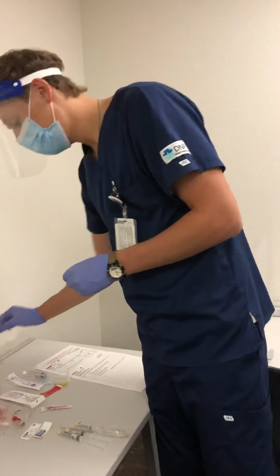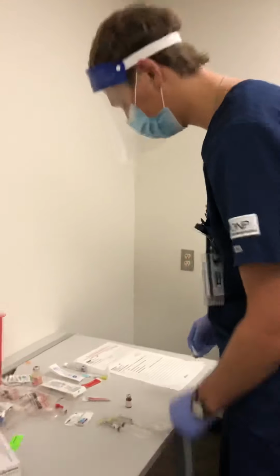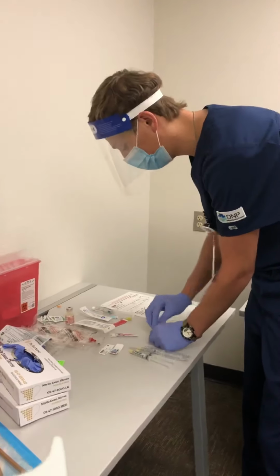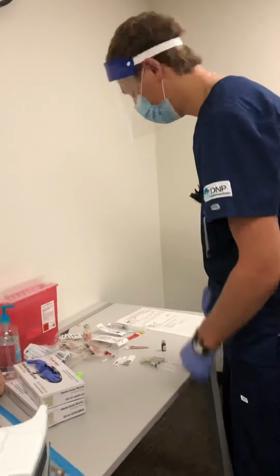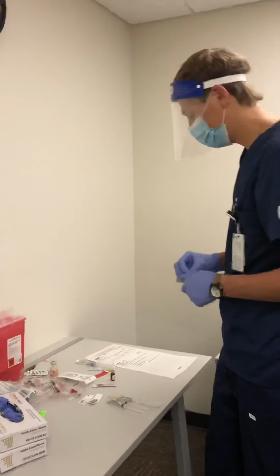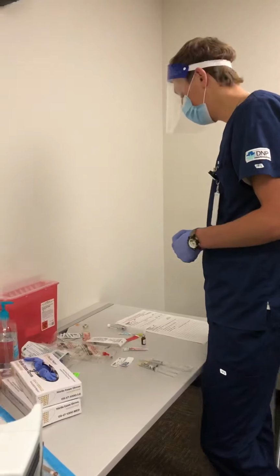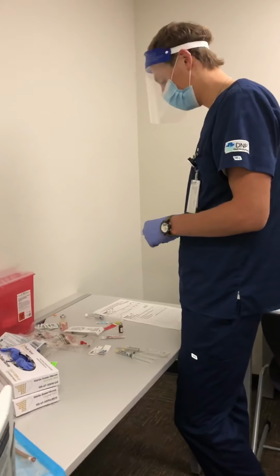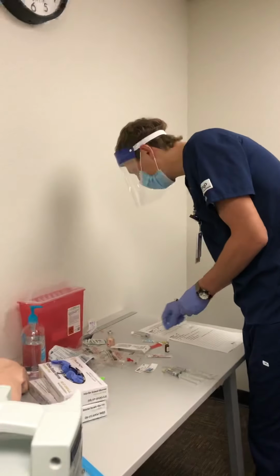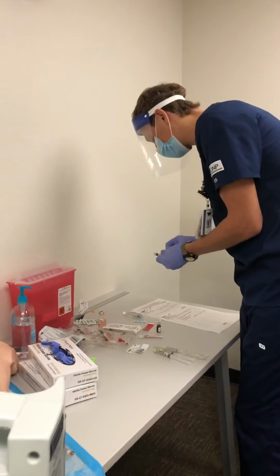I'm just going to uncap it and go ahead and clean it. Okay, clean for 10-15 seconds, inward to outward motion, and then I'm going to let that sit there and dry while I prepare my needle. So all these are intact, they haven't been messed with in any way, they are not expired, so I'm going to open them up. Just throw that away. And needle out here.